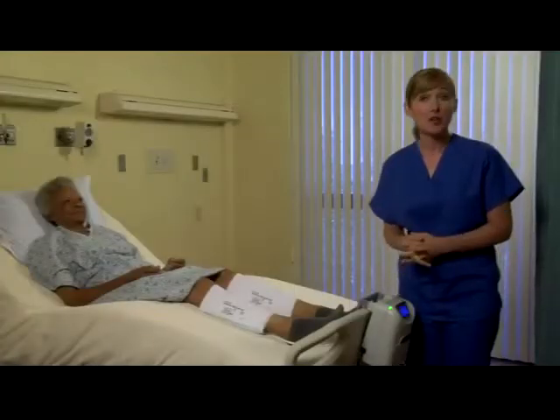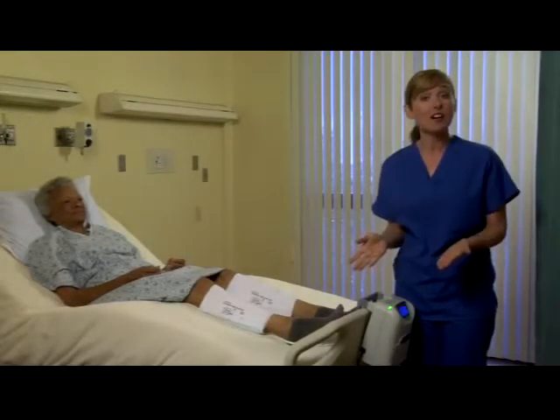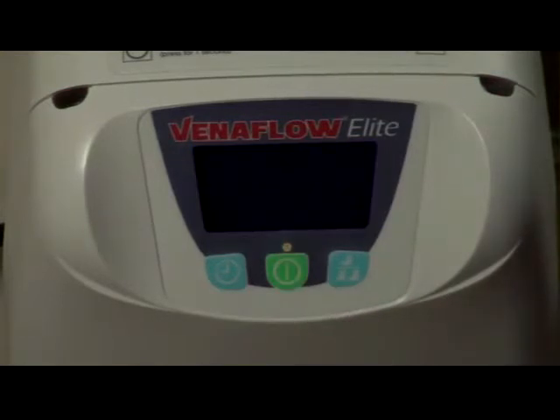Now we're ready to troubleshoot. If there is a discrepancy between what the device detects and how many cuffs are attached, the device will go into a leg alarm. If this happens, simply press the green on-off reset button and ensure the screen and the number of cuffs attached match.